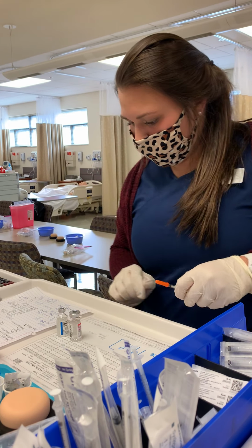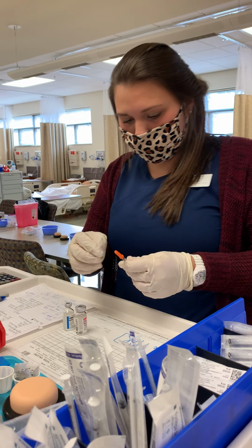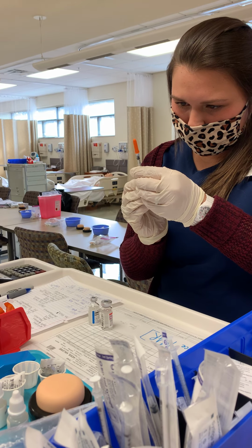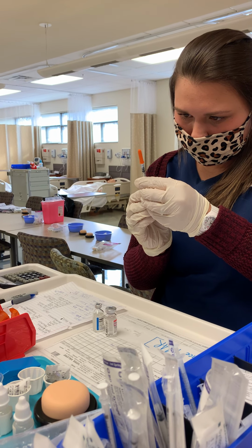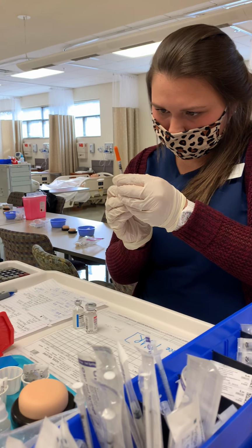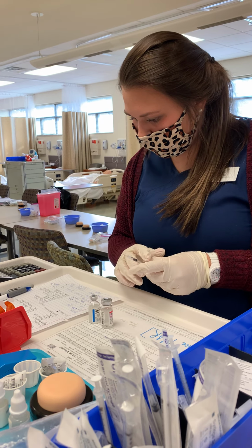All right, so my total is going to be 11 units total. So I'm going to draw up my air for 11 units.